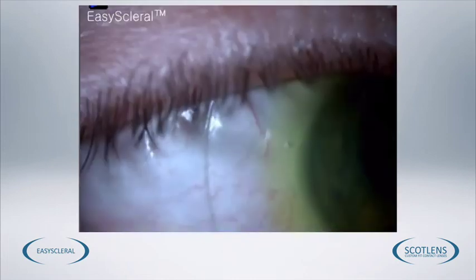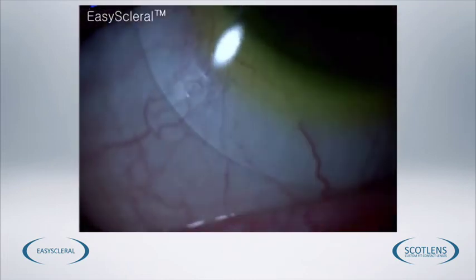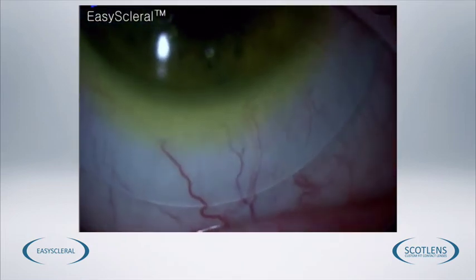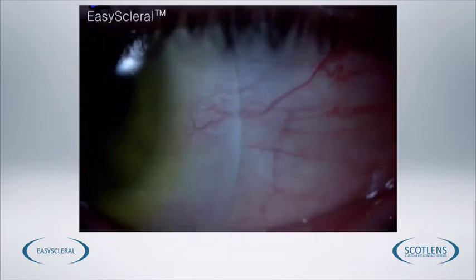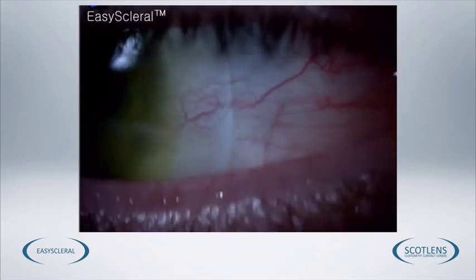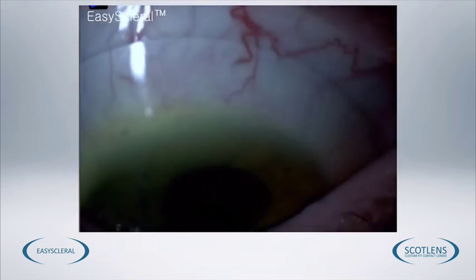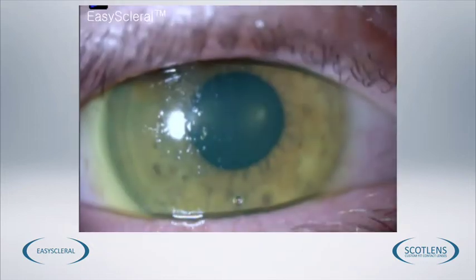Again, with white light, we get the patient to look, and we're looking for the blood vessels to see that they track underneath the edge of the contact lens without being cut off. In this video, there's very mild nasal blanching. Now, the nasal sclera is the flattest area of sclera on average, so sometimes we can get mild blanching. If the eye doesn't become hyperemic and irritated with wear, then the chances are we've got a suitable scleral fit.